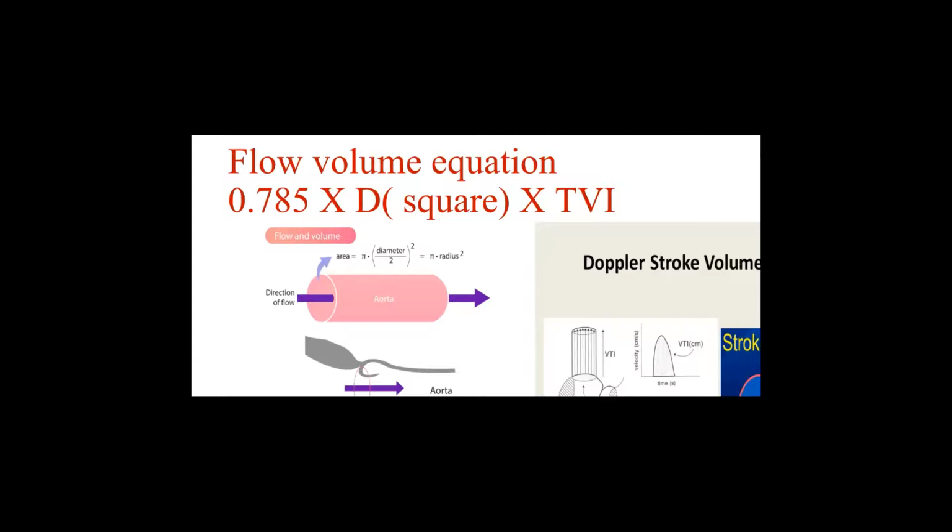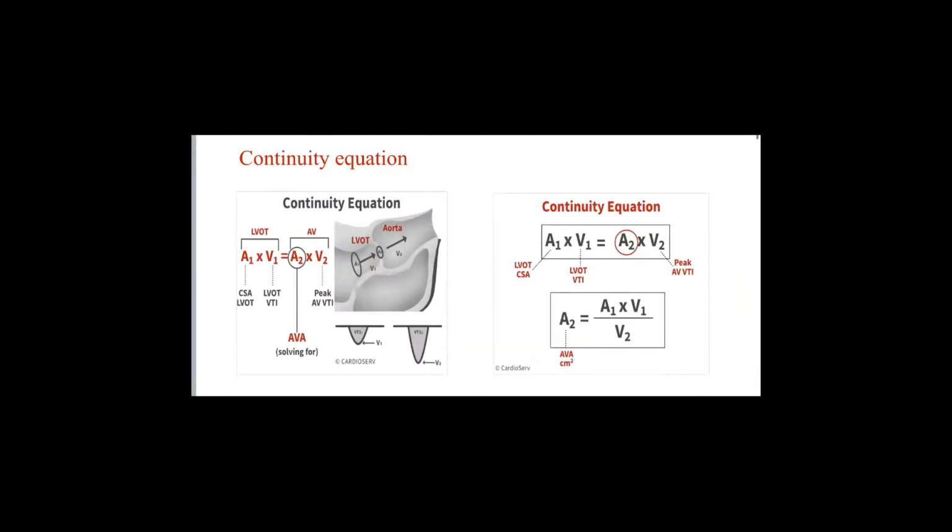Okay, good. Now, what is the continuity equation? Number 3, the equation number 3, continuity equation. What is continuity? Here, continuity. For aortic valve area calculation.